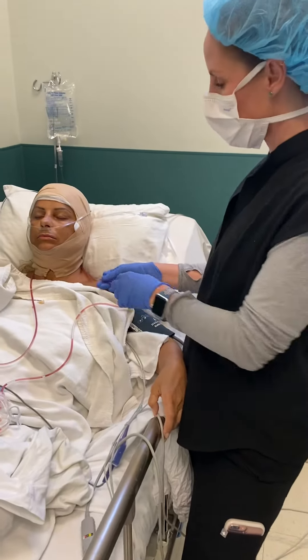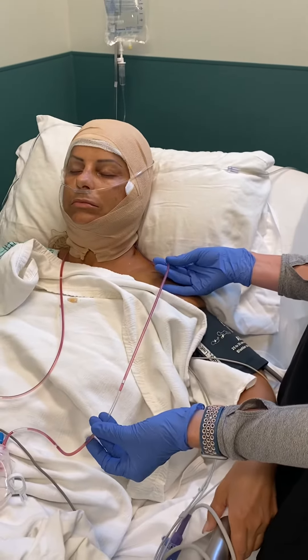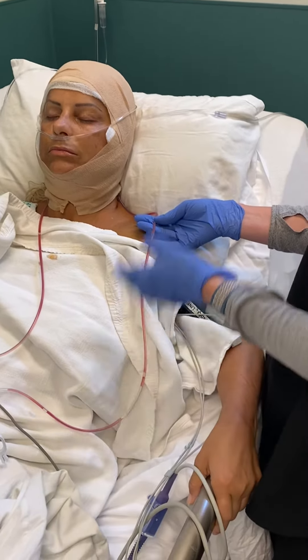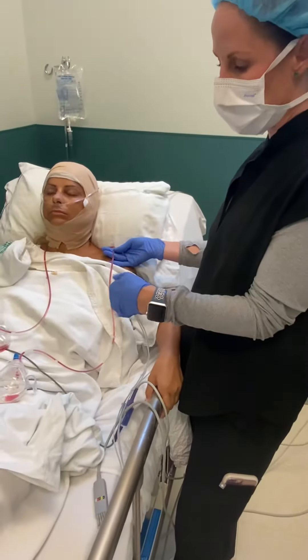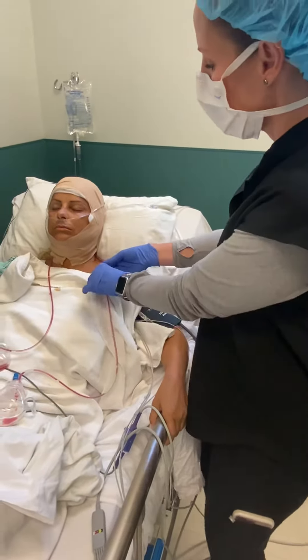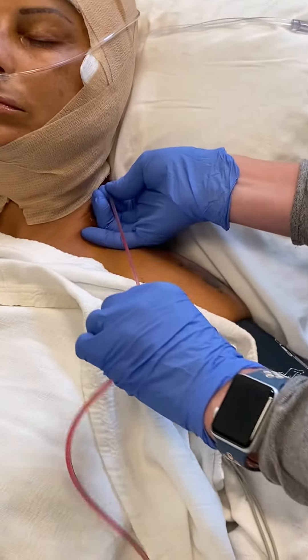The first thing that we like to do is milk the drain a little bit, in case there were any clots in this tubing. It could kind of push those through so that they're not getting caught up, so the fluid isn't getting caught up in this tubing. You want to just kind of hold with this hand here and milk it like this.